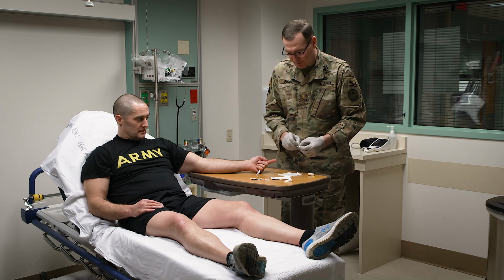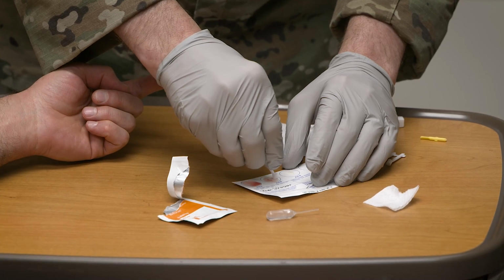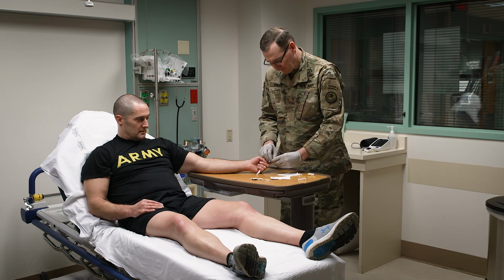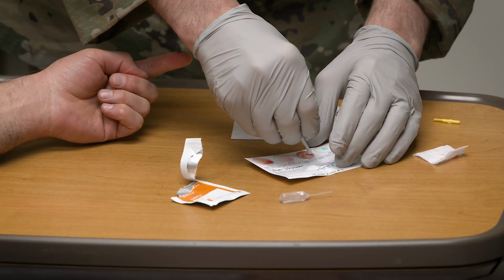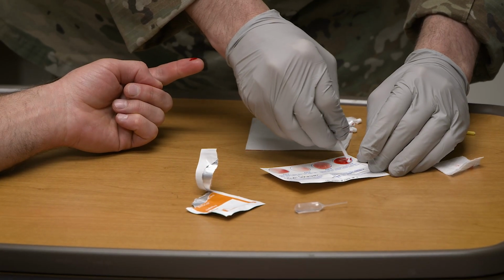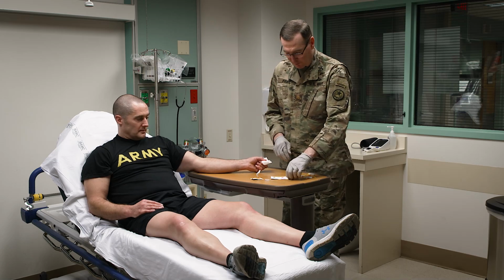Make sure you only use one Eldon stick per circle. This is repeated all 4 times. If you end up with a little extra blood, just wipe it off as needed. Okay, once that's complete, you can dry off your donor, your patient's finger there, and we'll wait for these to result.